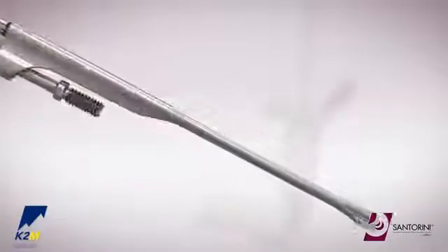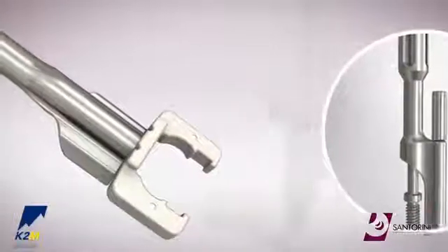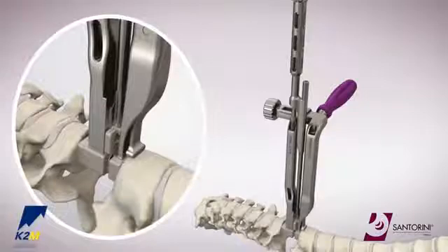pass a clip inserter inner shaft down the clip inserter and thread the inner shaft into the clip. Align the flat edge of the clip inserter out towards the laser line on the end of the clip. Slide the clip inserter down the ramp of the distractor arm.